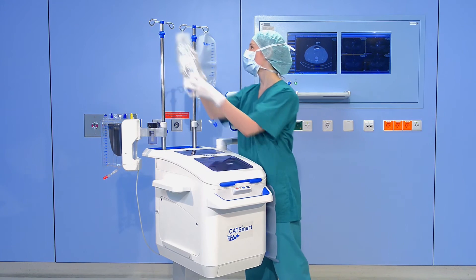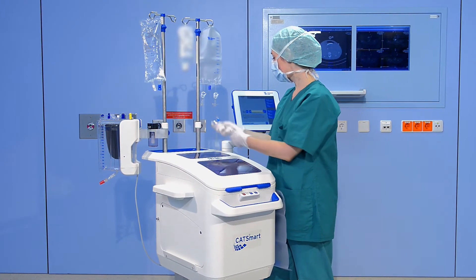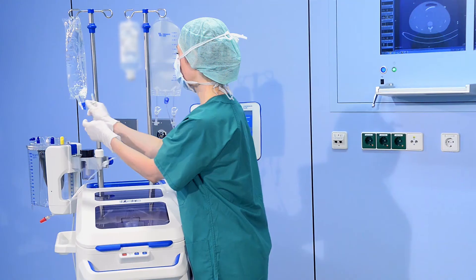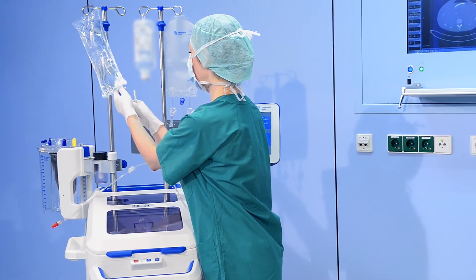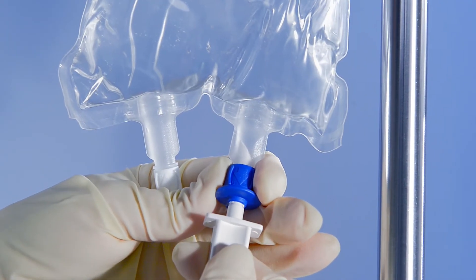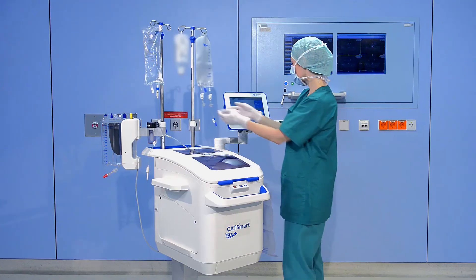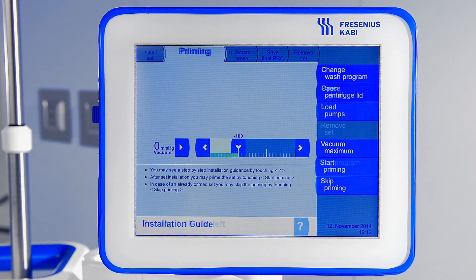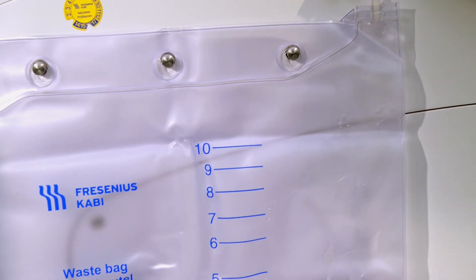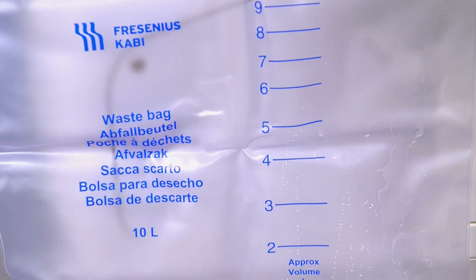Hang a bag with saline on the IV pole. Connect the saline line by using the spike. Close the two white clamps of the PRC bag. After the set has been installed and the saline has been connected, the set is automatically primed with saline by pressing Start Priming. You may now monitor how the set is being primed.